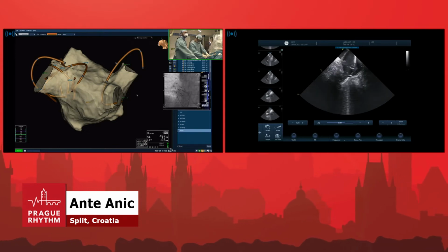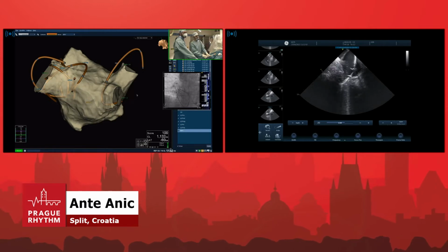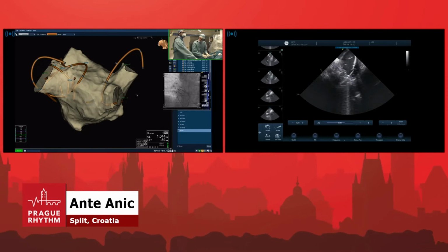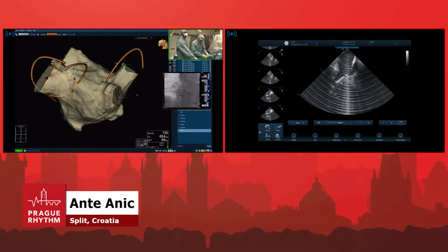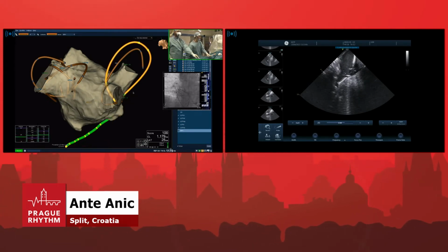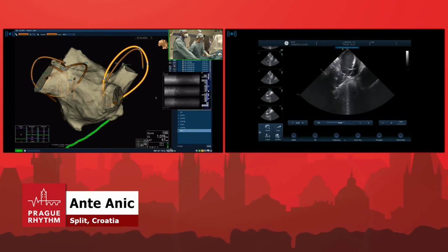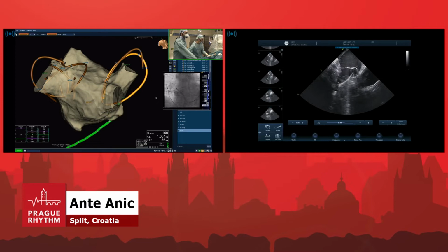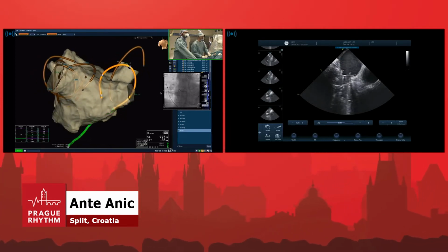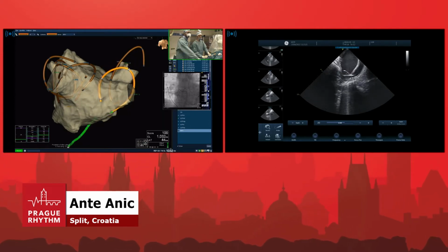Very nice. I like this. And right inferior PV, pulse 8. Now, go. Thank you. Okay, now let's stay in AP. Are we in AP, Predrag? Okay. Now I come in the flower. Come back to flower. Come back, and we go. This is a nice anchor to the right inferior. Predrag, you should see that I'm more posterior directed. You see, that's nice.